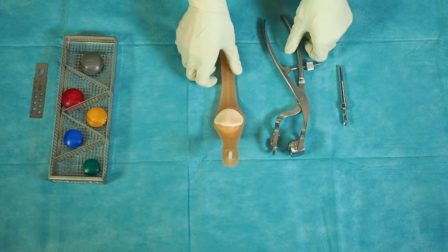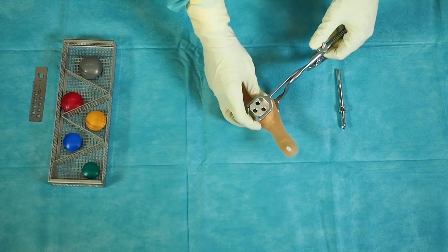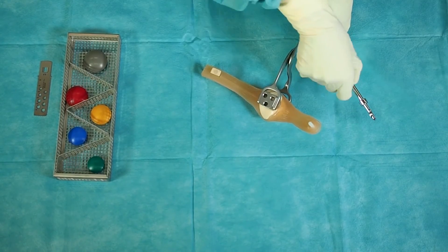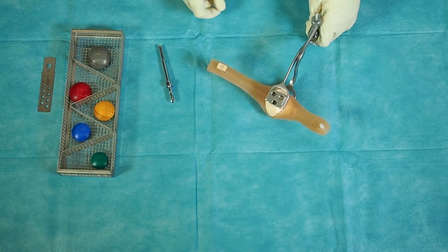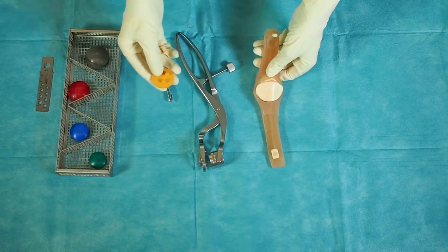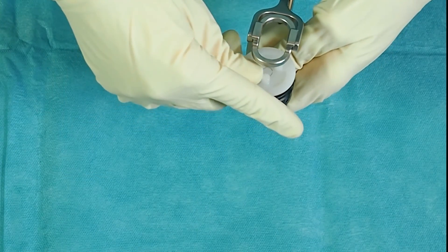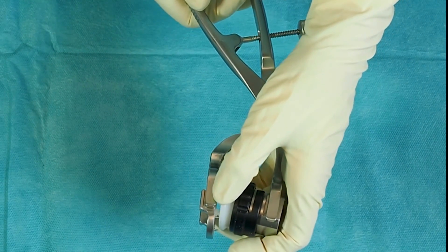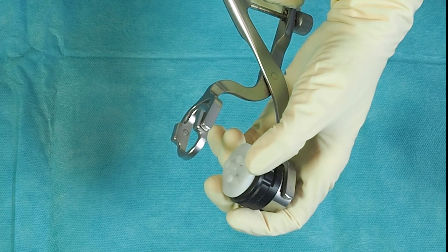The patella drill impaction clamp is set onto the osteotomized patella surface. The peg holes for the implant are drilled through the holes with the 6 mm drill until the stop is reached. The size of the patella is determined with the corresponding trial patella implant. The patella is implanted using the patella drill impaction clamp and the concave plastic cap, which allows good transmission of forces during the cement hardening process and at the same time protects the patella implant against damage.